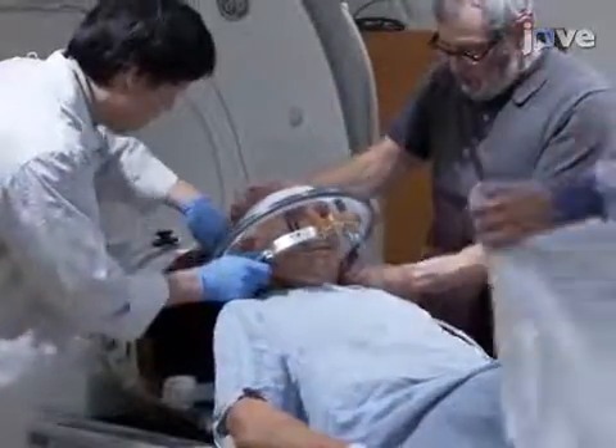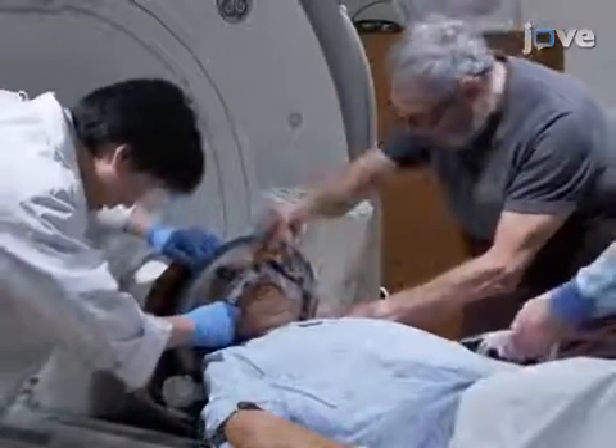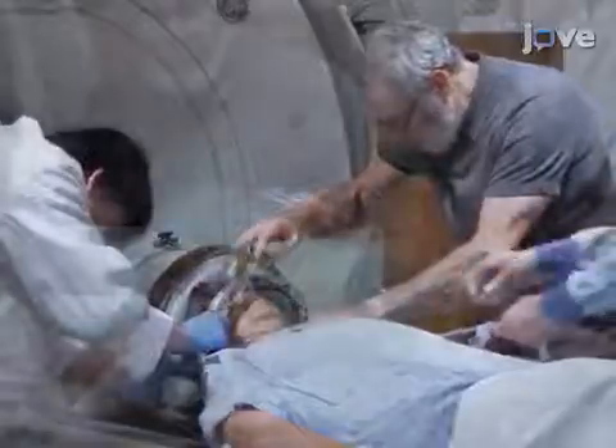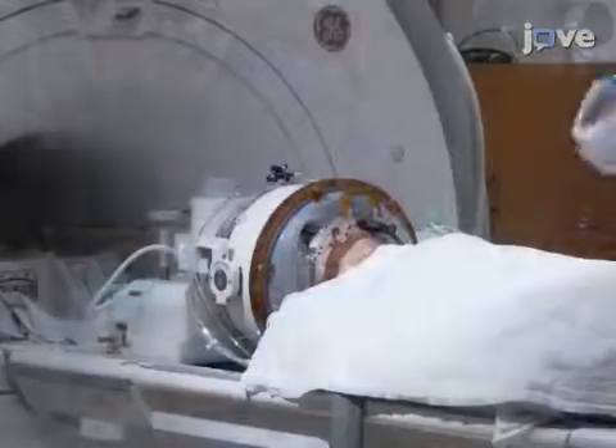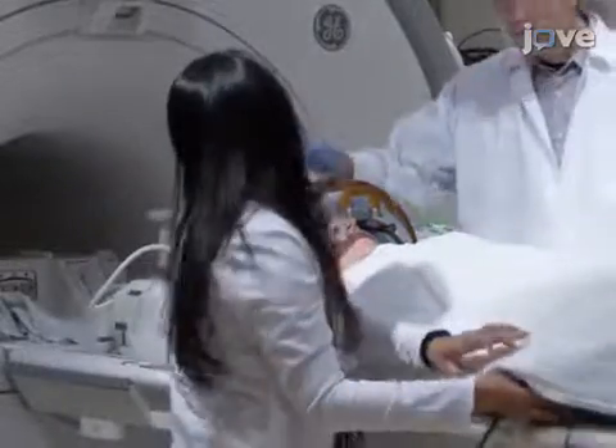Have the patient lie head first in the ultrasound helmet in the supine position and cover the patient with a warming blanket. Give the patient a stop button to allow pausing of the procedure at any time.